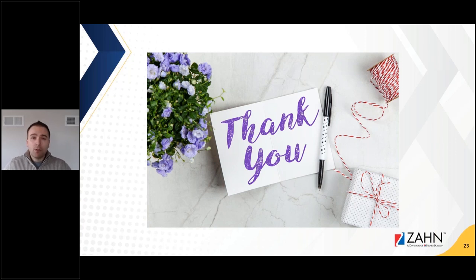Usually what you end up doing is you put some texture characterization, very light, because you can get a lot of that texture from the design itself, because the printer can also get a lot of that fine detail. But you're mostly going to focus on a little bit of individuality to individualize the teeth. And then you're looking at about a 0.5 millimeter cutback. So you can go ahead and maybe layer some composite, or you can do some glazing there and light staining. I would say it's a very labor intensive process. And if you're going to do it, you're definitely going to have to include it in your fee structure when you sell that denture to your dentist.